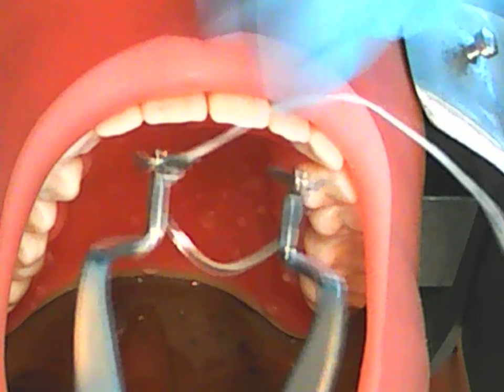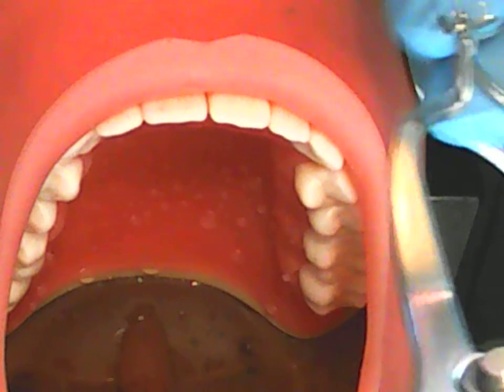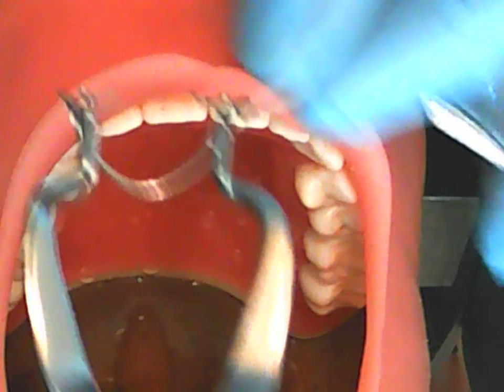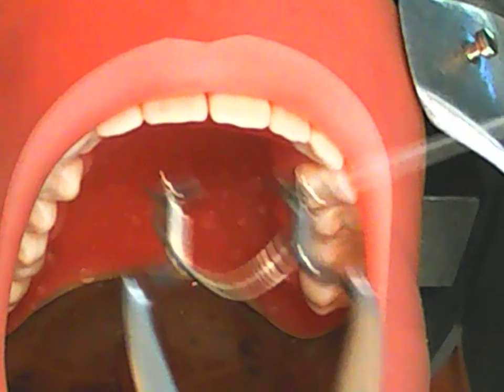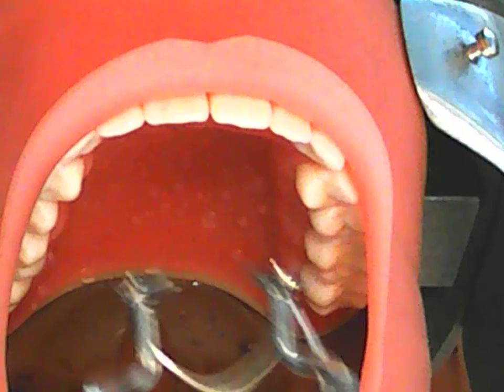Now I notice this floss, now that I'm orientated, is going to be on the lingual if I place it up here. So I'm going to switch that over to the buccal. There we go. Once you have that, you wrap the floss around the pinky finger of the hand holding your forceps. Again, that's for security if the clamp pops off the tooth while you're in your hand.